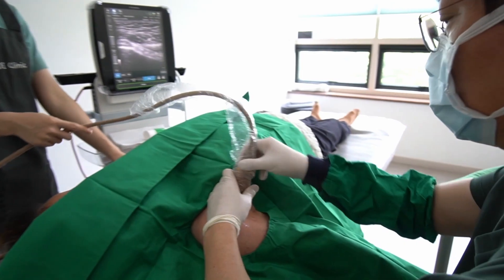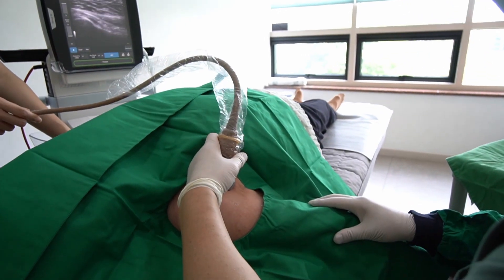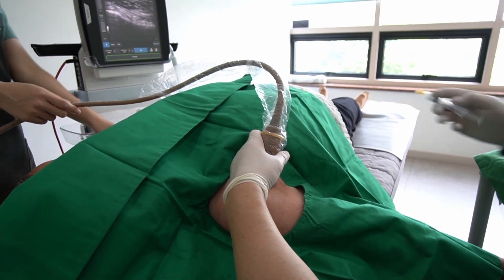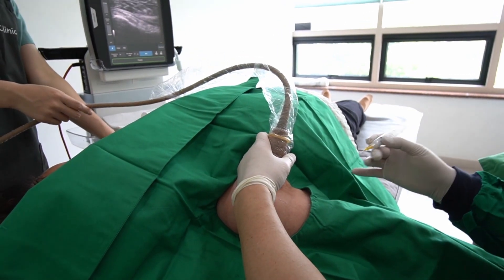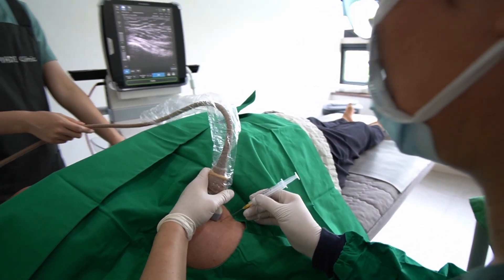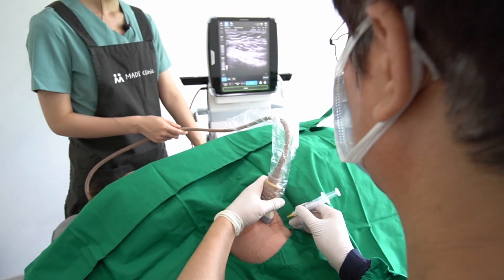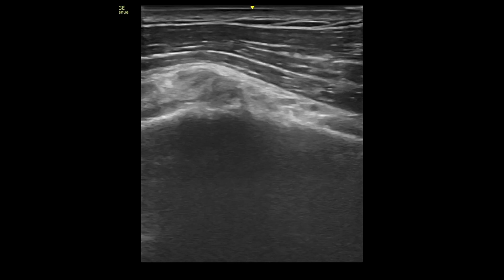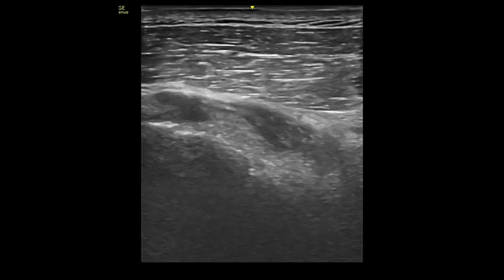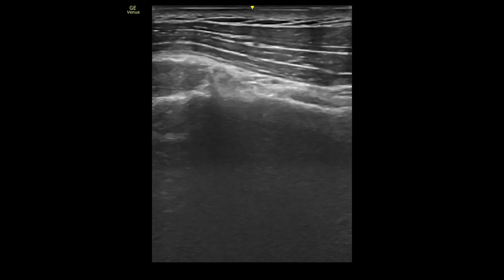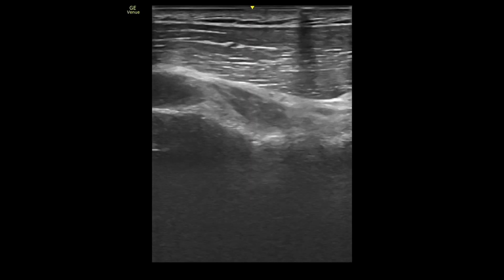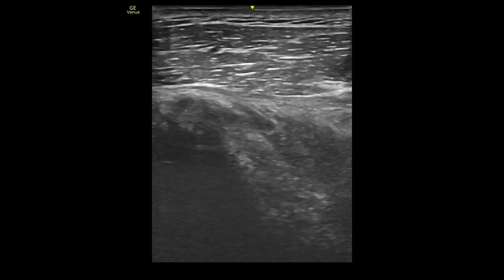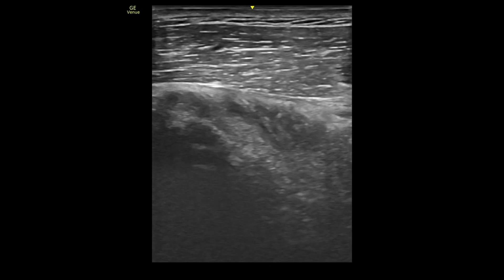Now let's proceed to target the inferior capsule. Many doctors need help understanding the 3D figures of the inferior capsule. They learn the joint capsule and overlying muscles separately. Also, the inferior capsule and internal synovial folds are overlapped. Also, the low echogenicity of the subscapularis muscle and inferior capsule makes it challenging to discern.